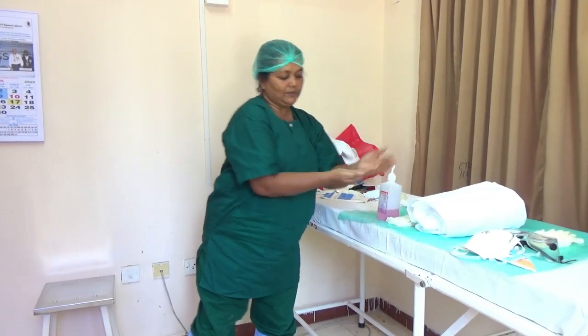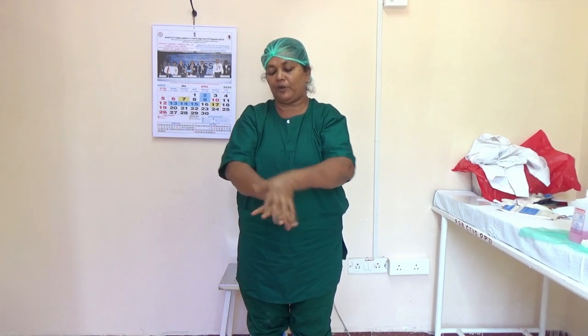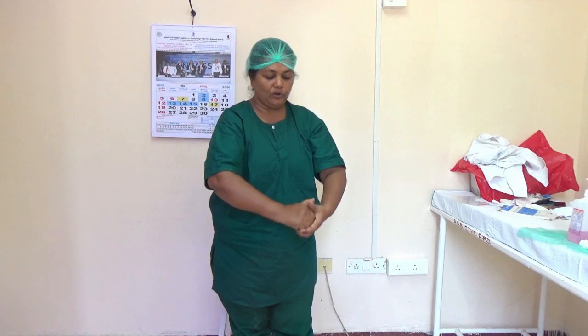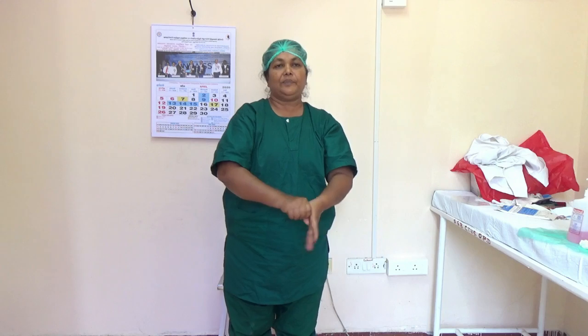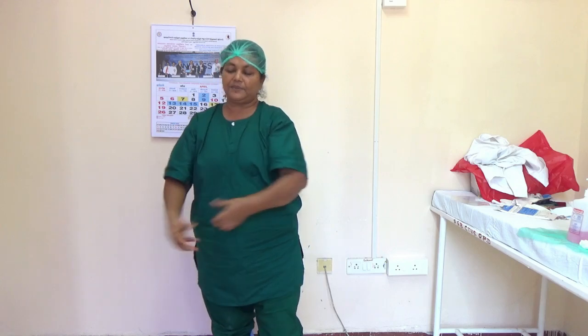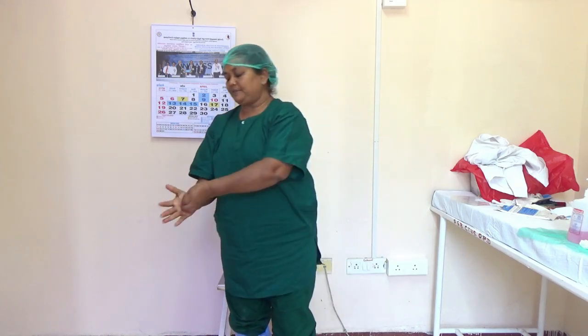Take two pumps of hand rub solution, that is 3 ml. Do palm to palm with interlace five times, back to palm with interlace five times, then the other hand back to palm with interlace five times, then interlace fingers for the web spaces five times, then interlock for the knuckles five times, the same for the other hand. Then both thumb fingers in rotational rubbing five times each. Then clasp fingers and rub the fingertip and inner aspect of the palm. When you complete all six steps, the hands become dry.